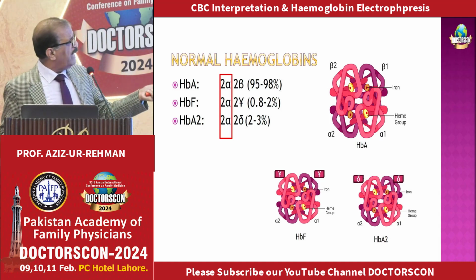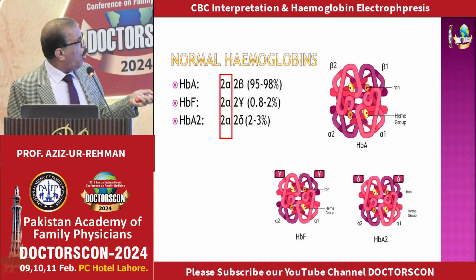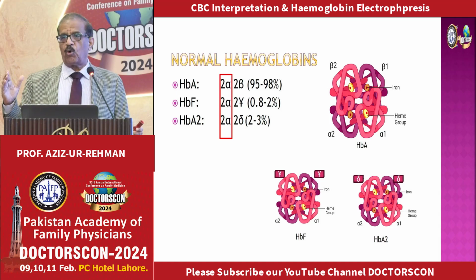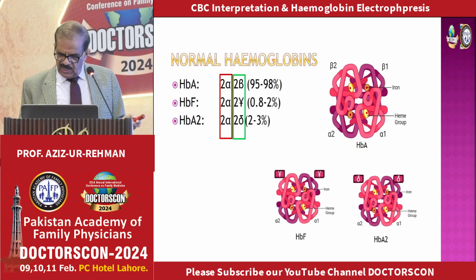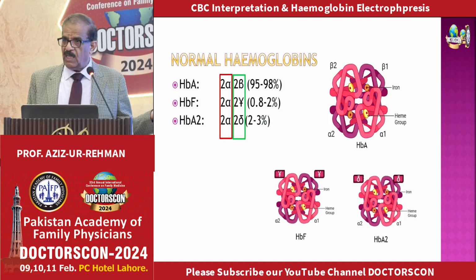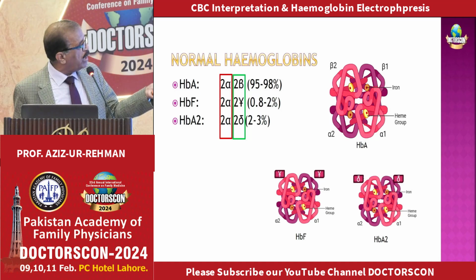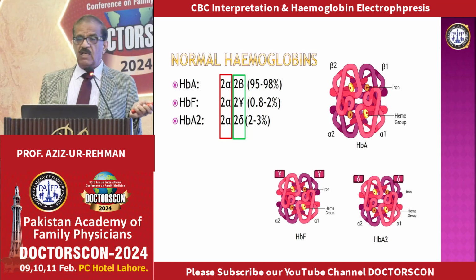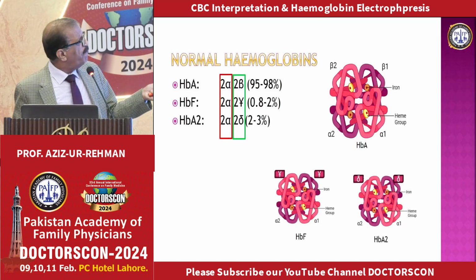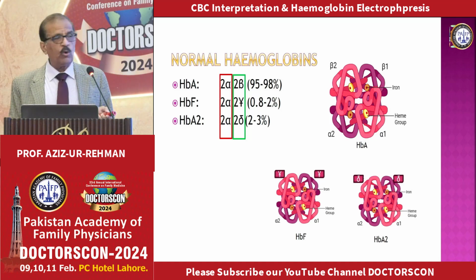If you see this, all 3 hemoglobins which are present in adults, and I'm mostly talking about adults, all have alpha chain. Alpha chain is indispensable. You cannot imagine a functional hemoglobin without alpha chain. Whereas beta chain is not indispensable. Beta chain can be replaced by gamma or delta. They will still be functioning hemoglobin, and we can identify these if they are higher in concentration. So in any condition, for example beta thalassemia, if beta chain is not made in sufficient quantity, these alternate chains will be made, and that will be detected by the test. This is the whole theory.